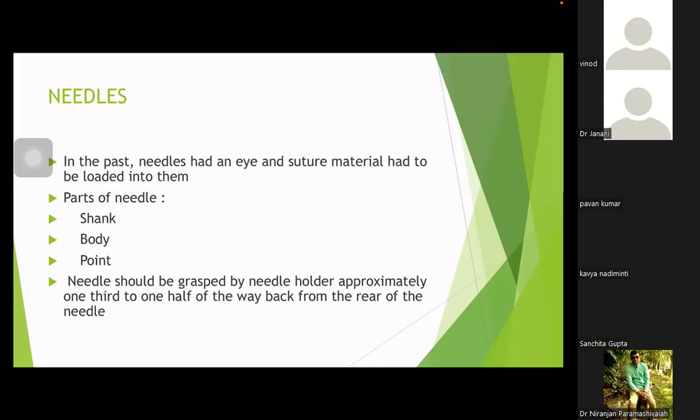Hari, what is the ideal suture material for abdominal wall closure? Slow absorbable, sir. Delayed absorbable, it's called. So what is the material? This one, sir. Polydioxanone. Polydioxanone, what is called PDS, which is number one PDS. You should mention that too.